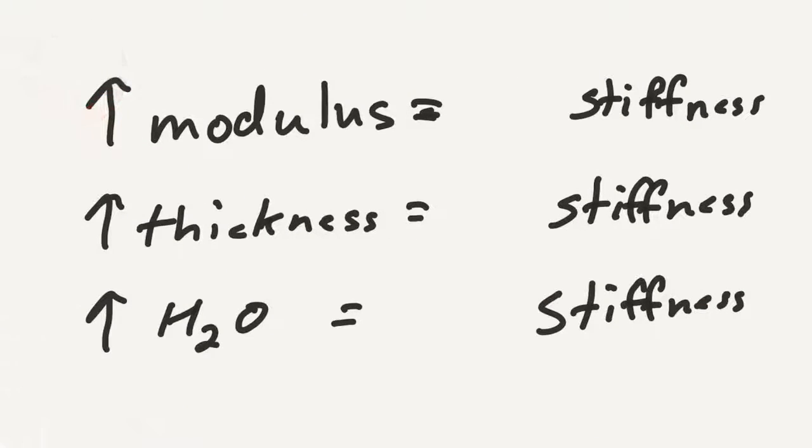Now let's talk about rigidity of a contact lens, and really rigidity breaks down to the stiffness of a contact lens. So in my book, I wrote right above rigidity, just wrote in stiffness of a contact lens, to just kind of simplify that in my mind. And you guys can also highlight that in the text, those of you that love highlighting stuff, describes the stiffness of a material, right? Now it's dependent on a couple of factors. So I kind of drew up this in my book.